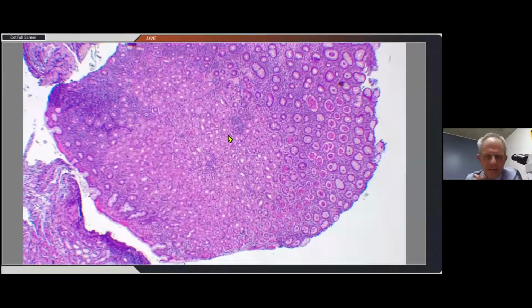Right, thanks, Bob. I'm not sure if there are any questions. No, there are some, but let's wait for the pathology. Okay, right. So can everybody see that histology?